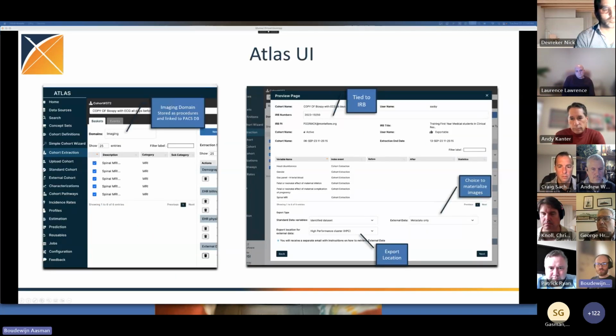So in full disclosure, we are nearly done integrating these pieces into Atlas. Right now, this is a service we've been providing to the university. But right now we're launching these pipelines manually for the various different teams like radiology and other teams.